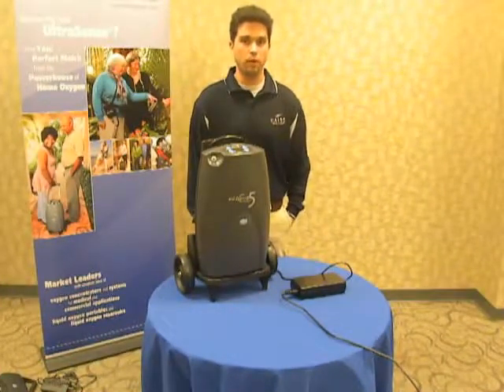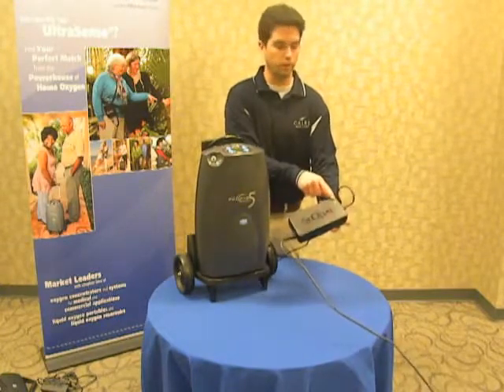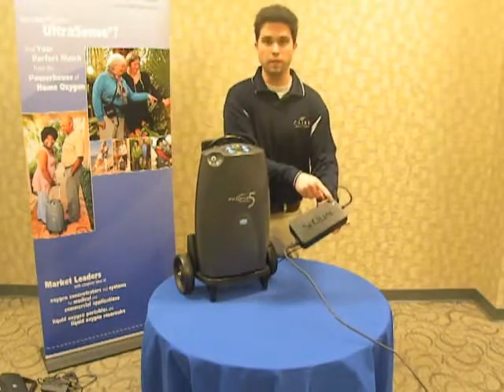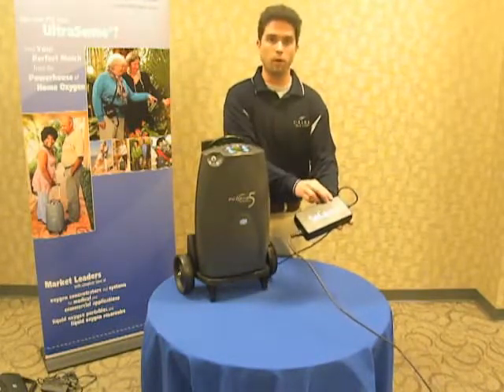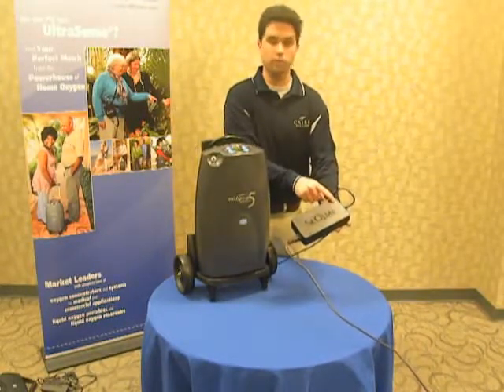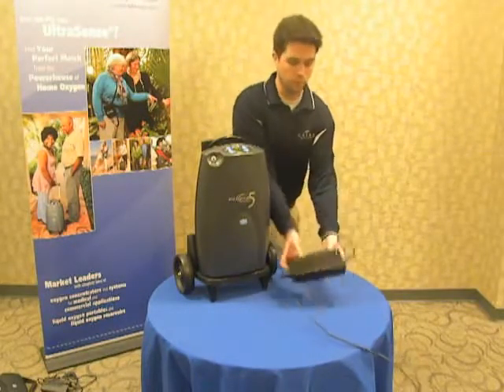When you're plugged into a wall outlet, there's a green light in the top corner of your power supply brick that will light up. It's important to recognize this light because if the cord were to come loose or you were to come loose from the wall outlet, this light will go off. This light indicates that you are properly receiving power from the wall.